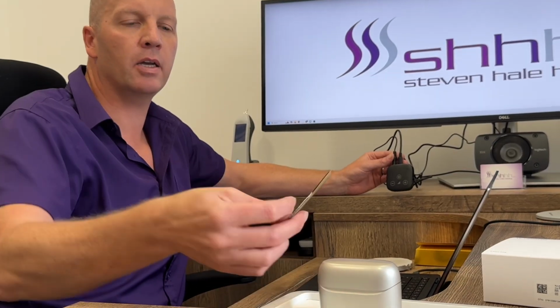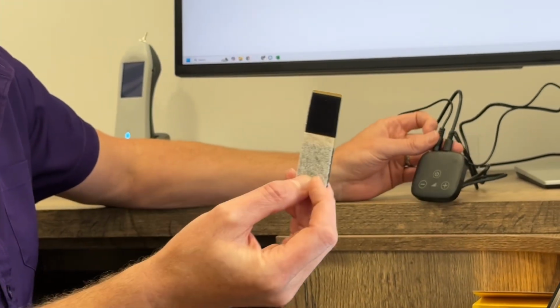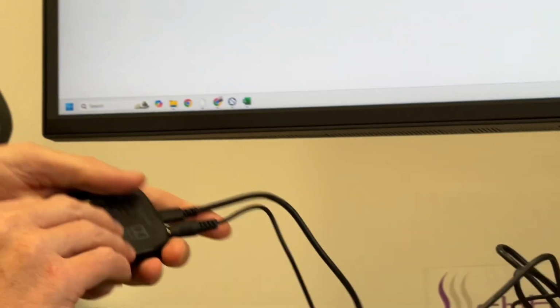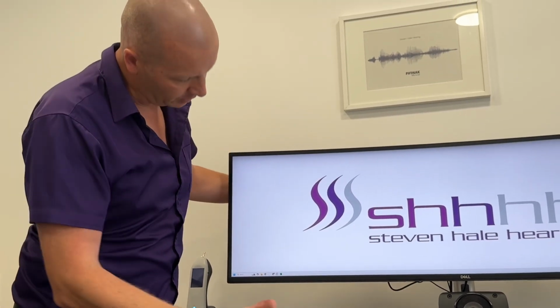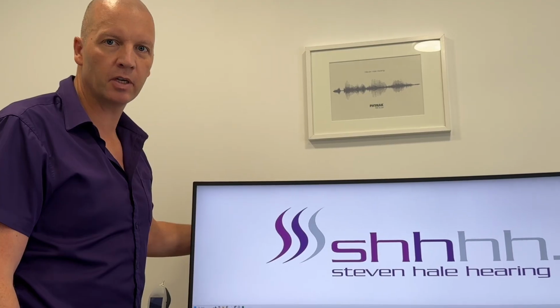So in your pack, you'll have thought, what's this? Okay, this is just some Velcro. And it's as simple as just peeling that off, one side onto the back of the TV connector, one onto the back of the TV, and we're then going to just stick that onto the back of the TV so you can't actually see any wires coming out of it.